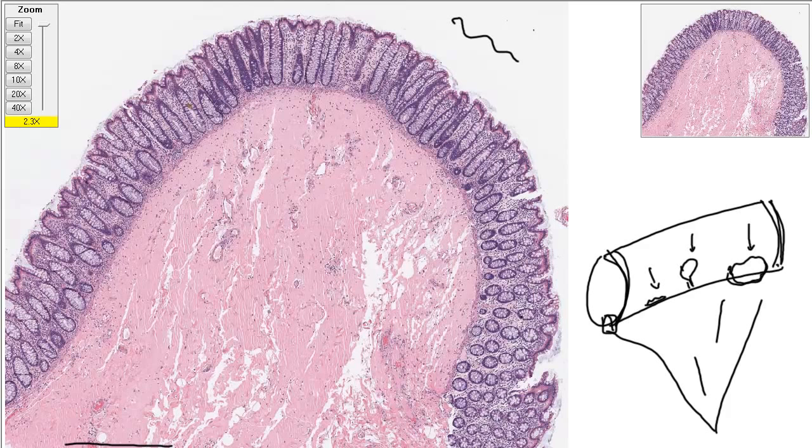This is a virtual slide in which we took the typical glass microscope slide and put it in a special machine which took lots and lots of photographs at high power and stitched them all together as one massive image. I see. So that then allows you to zoom in and look around.